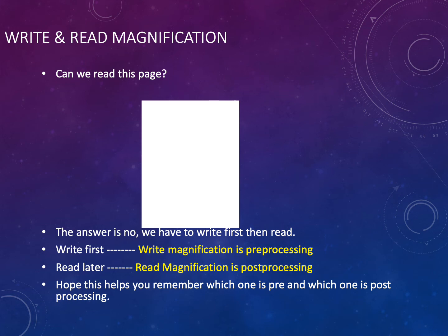Okay, write and read magnification. Write and read magnification are also known as write and read zooming. What is write and read magnification, and which one of these functions is pre-processing and which one is post-processing?